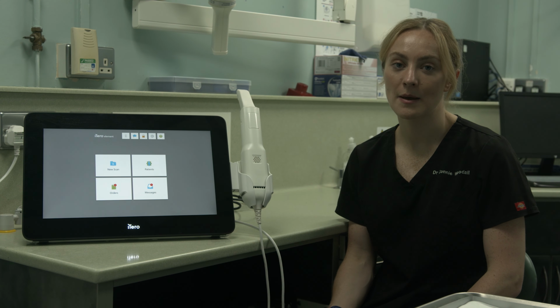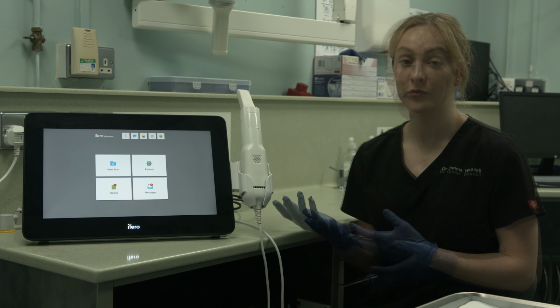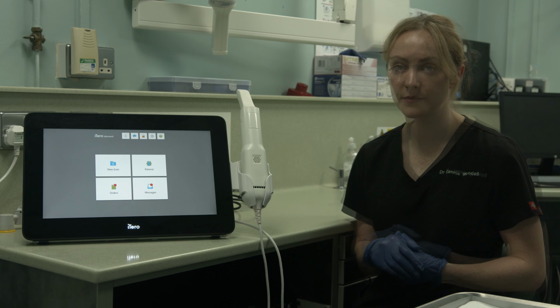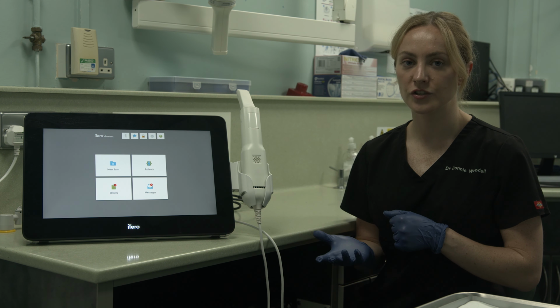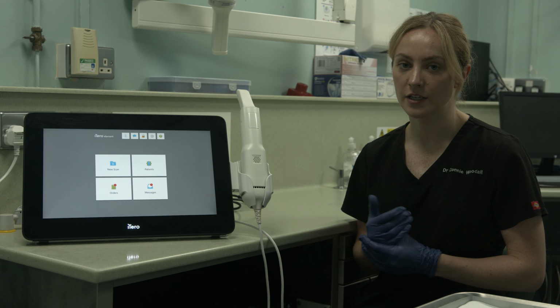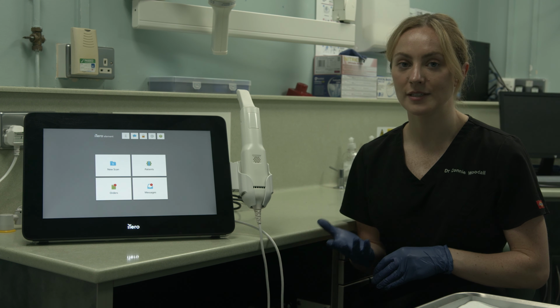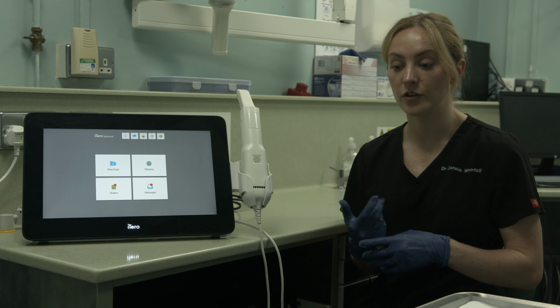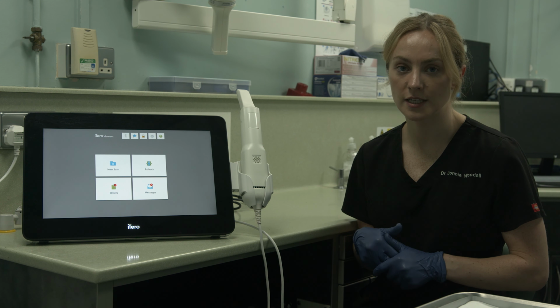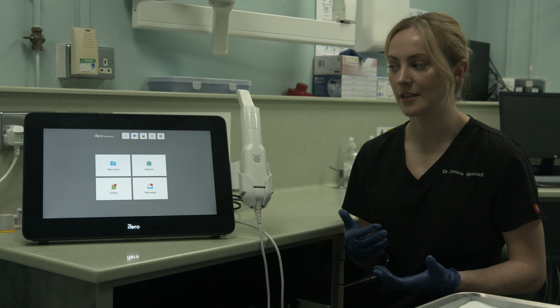You can also get other members of the team involved with the scanner. Even before it arrives, nurses and therapists and receptionists can do modules on iLearn. When the scanner does arrive, I'd encourage you to train other members of the team, get them enthusiastic about the scanner use, and it will also take some of the scanning burden off yourself. So if you do an orthodontic consultation, the nurse can actually scan the patient while you're writing your notes up, just to make things nice and efficient.